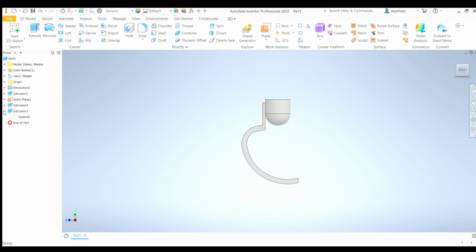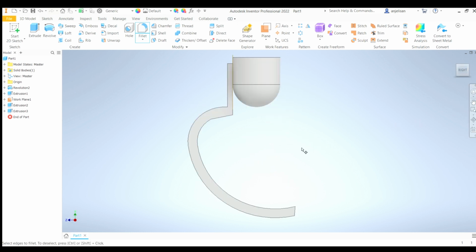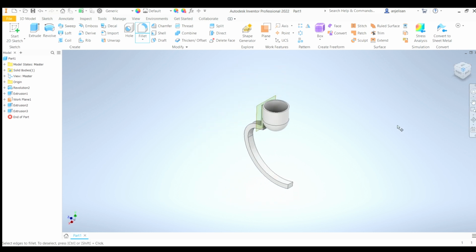And you can still, like I showed you earlier, make modifications even after finishing the sketch by double clicking and going into the sketch. I think I'm okay with this. I will add some fillets just to finalize this 3D model. Now fillets aren't just aesthetically pleasing and get rid of sharp edges, but I think they make the structure a lot more structurally stable.